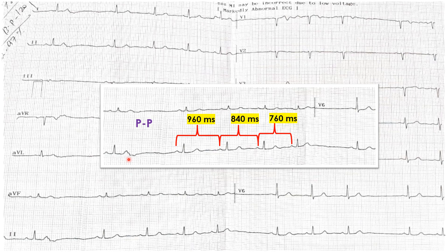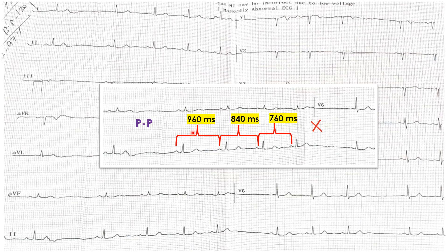The problem can be either due to automaticity or due to impulse conduction down to the atria. Whenever you see a sinus pause, always try to look for problems of impulse conduction. These are called sinoatrial exit blocks. Now, looking at the zoomed-in rhythm strip with marked intervals, the PP interval is getting shorter: 960ms, then 840ms, then 760ms, and then there is no P wave until one fires here.